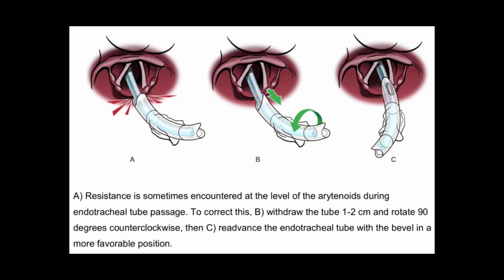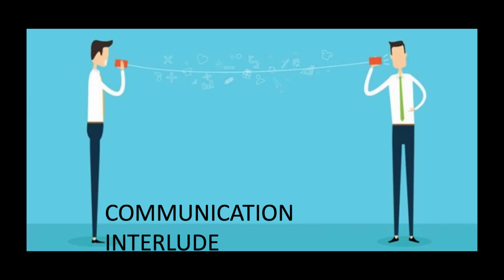If this ever happens, just continue to maintain a view with your direct laryngoscope in its usual position, and rotate the endotracheal tube 90 degrees to get the bevel up, and it should pass through over the arytenoids fairly easily. Using a bit of ELM at this position may also be favorable to decrease any kind of hyperacute angle that the bougie has taken to go through the cords.